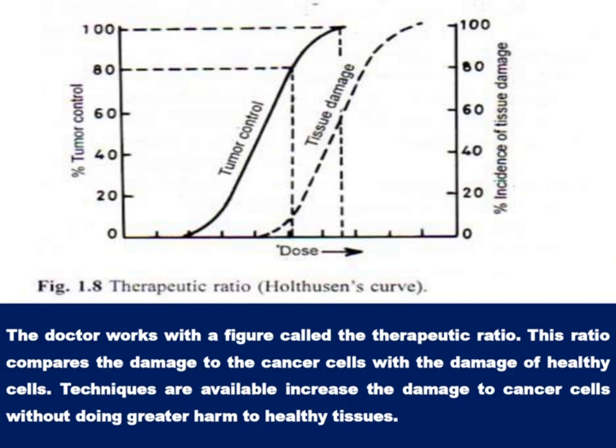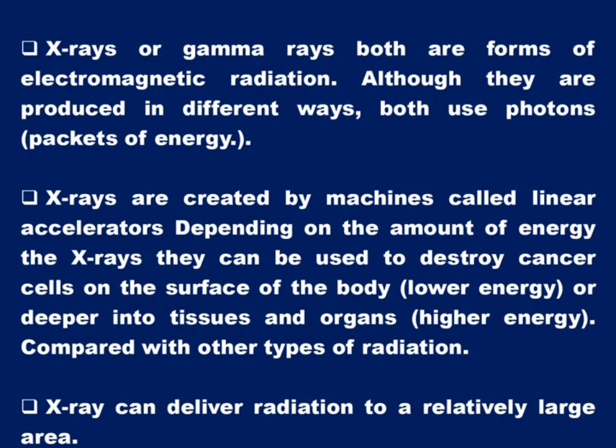So you see here, when the electron beam hits the target, this is the way of generating the X-rays. The few beams of X-rays, you can say beamlets, are of lower energy or more scattered, like 400 kV, and then 4 MV, and then you see here in the diagram 20 MV. After the electron beam hits the target, a spectrum of energy is released. So we do not want the spectrum which is not useful. We want deep penetrating.